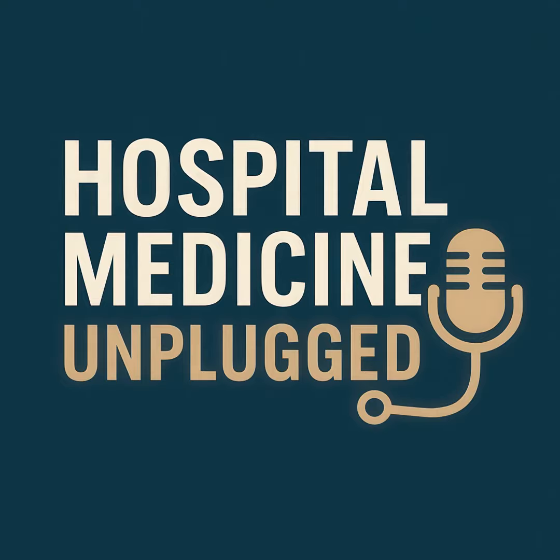Clinicians sometimes hesitate, maybe hoping for a turnaround, but the data suggests prolonged ineffective NIPPV in this setting leads to worse outcomes, likely due to that ongoing lung injury we discussed. Having clear stopping rules before you even start is the best way to avoid this trap.